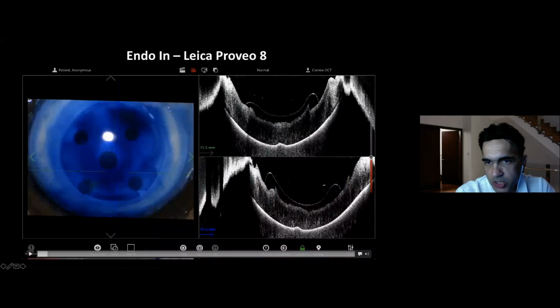okay, if you watch the OCT over here, you will see how much fluid there is, and the fluid level will drop down, so it is just covering the endothelium. Okay, and this is important because, again, you need to be able to somehow ascertain how much fluid there is there.